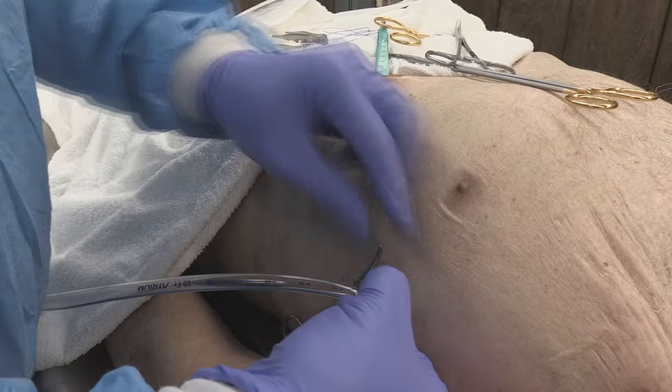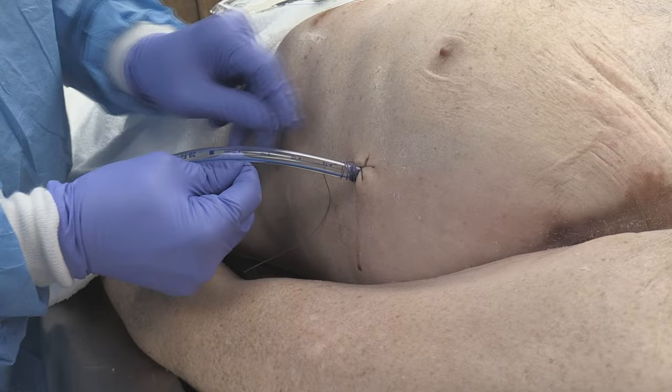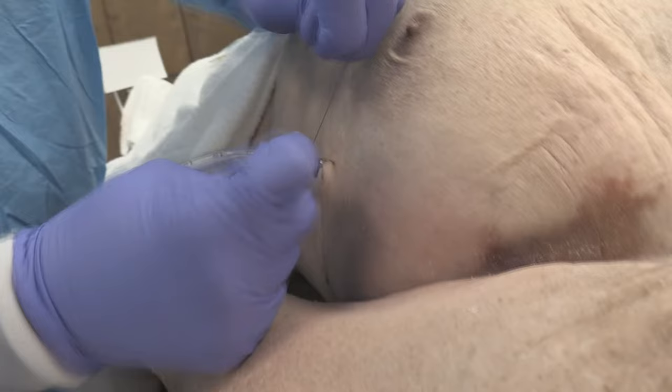I then basically just secure the tube by throwing it around. As I loop around, I'm going to take this piece with my mosquito and bring it through. Optimally, I'd like to have longer pieces of thread. And this is then secured.